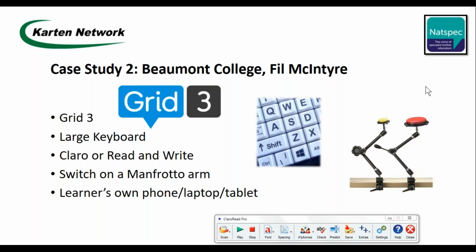There's loads of pre-made content for Grid 3. Unfortunately, a lot of it is aimed at younger users, so visually it's quite young. But the power of it really is that you've got a blank canvas to create interactive resources, quizzes, even using things that contain web browsers, and it's all contained in the one package, so the accessibility is all built in.